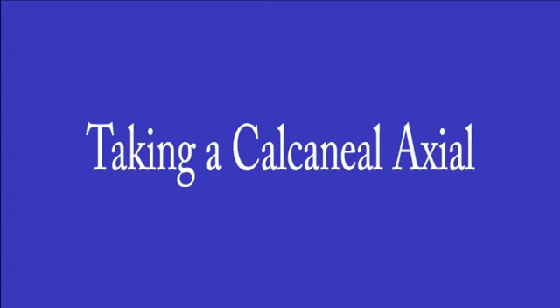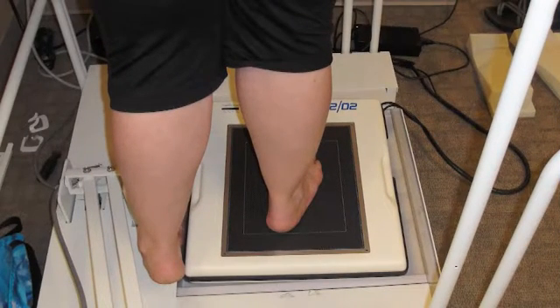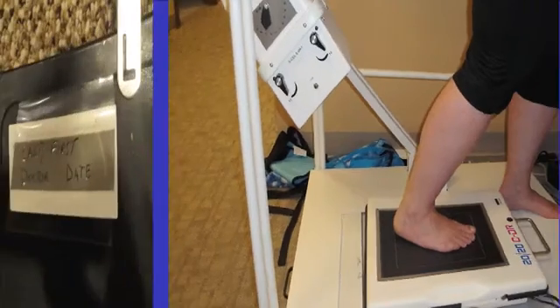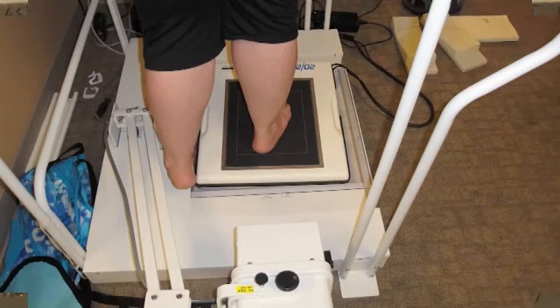And finally, the last of our special views is the calcaneoaxial. This view allows the physician to visualize the heel and check for any fracture or spurring that may occur. This view is shot much like the AP, except you will not need to partition off the cassette, and the angle, instead of 15, will be 45 degrees on the X-ray head. You will prepare the cassette by placing the name label and left-right indicator in position. You will then lay the cassette flat as an AP and have the patient turn with their back towards you.